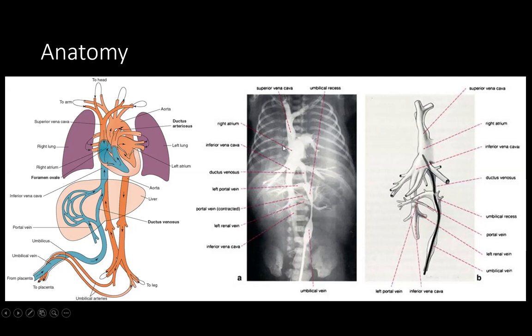This is a simple venogram of the umbilical vein. The umbilical vein goes up, this is the umbilical recess where it joins the left portal vein. From there it goes posteriorly through the ductus venosus, joins the inferior vena cava, and continues towards the right atrium.